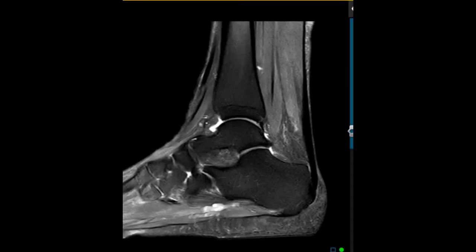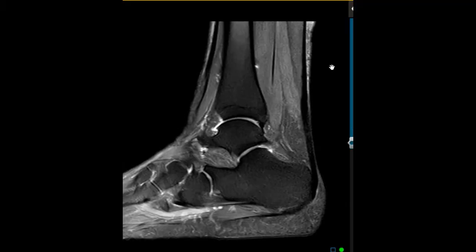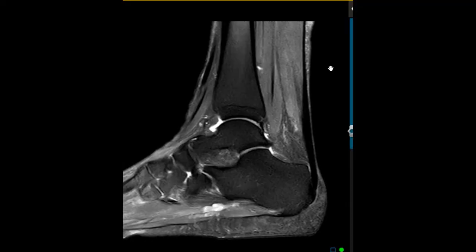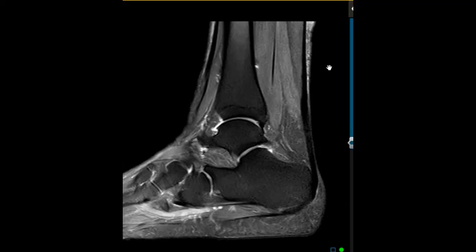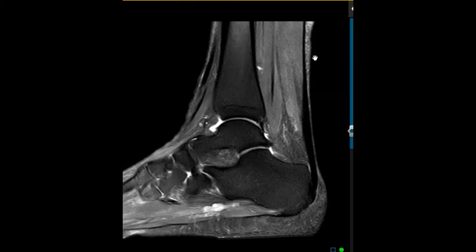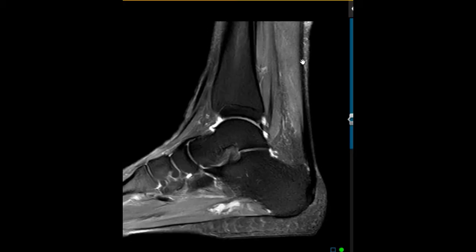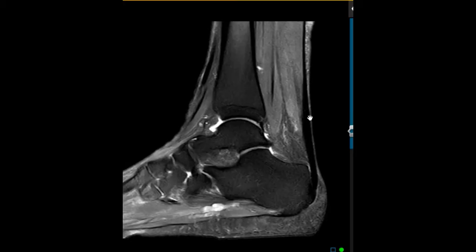Hey, this is Dr. Gay from First Psych MRI, and this is a quick example to show you what an Achilles tendon tear looks like. These are fairly common and pretty straightforward diagnosis. We can see the heel back here — this is the calcaneus — and the Achilles attaches here on the posterior calcaneus, and it looks like a dark cable coming down here.